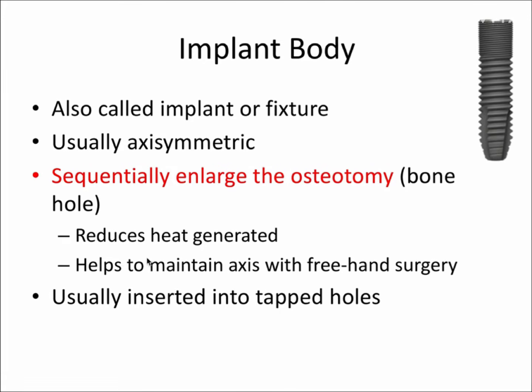Secondly, it helps to maintain the axis with freehand surgery. So what the heck does that mean? Well, when we're doing an implant placement, we can be using a stent or a template of sorts, and we'll talk about that a little bit later, or you can be placing the implant free-handed.